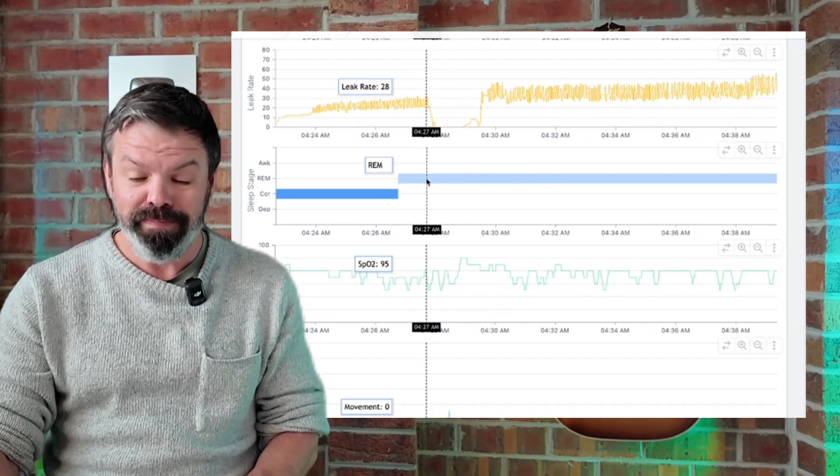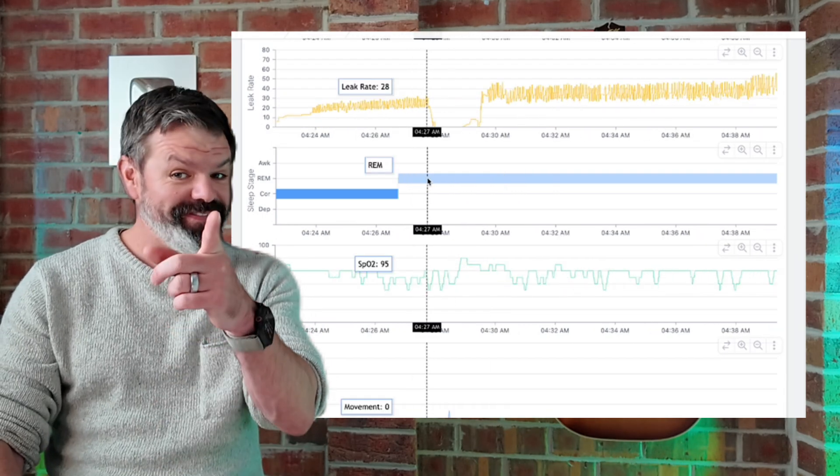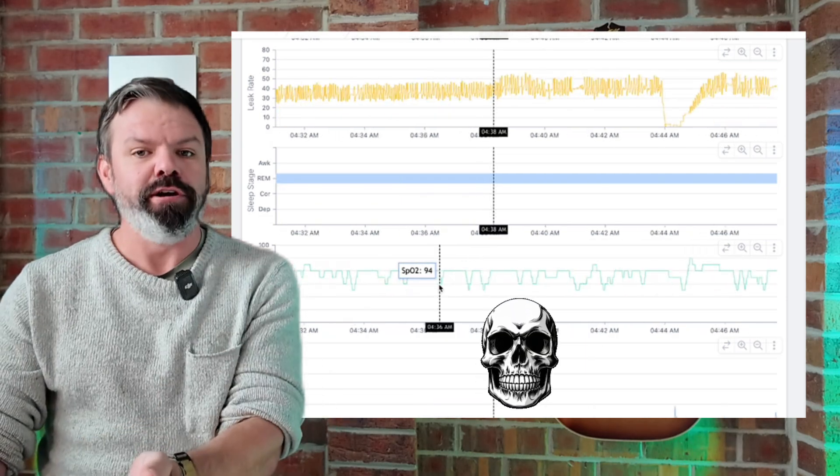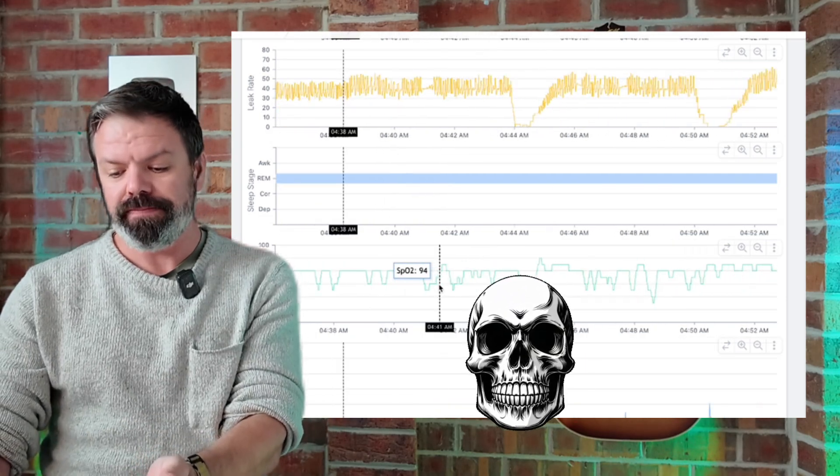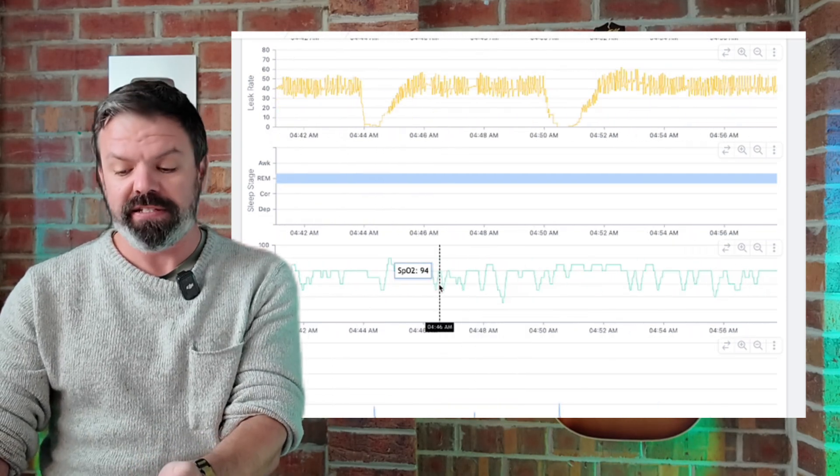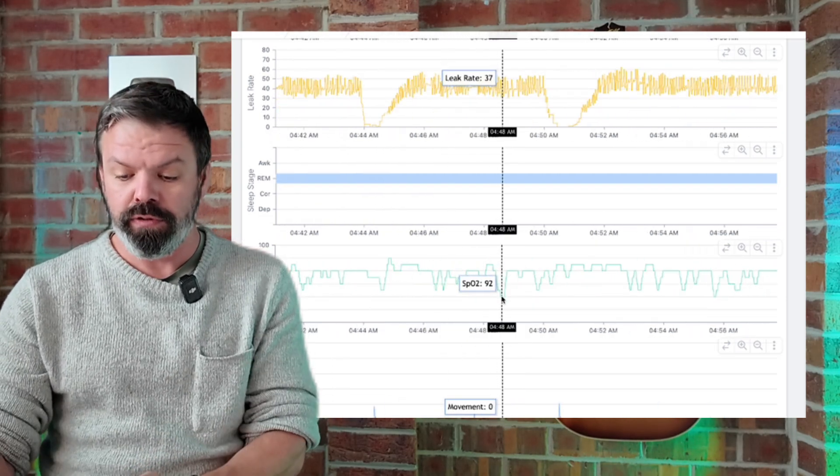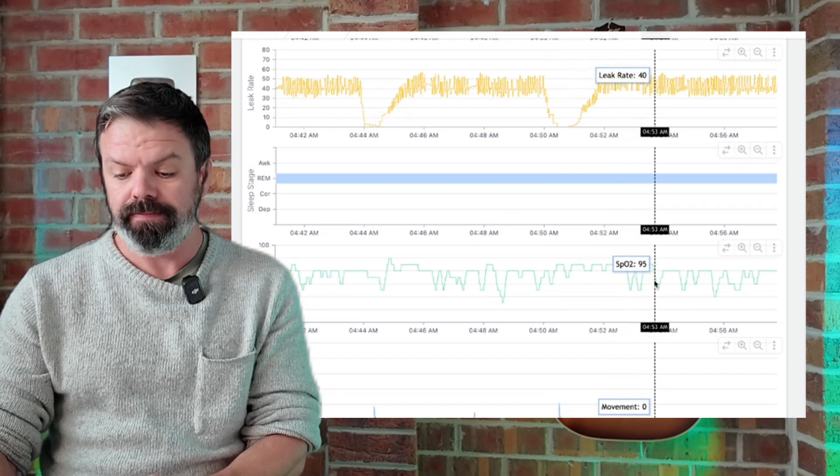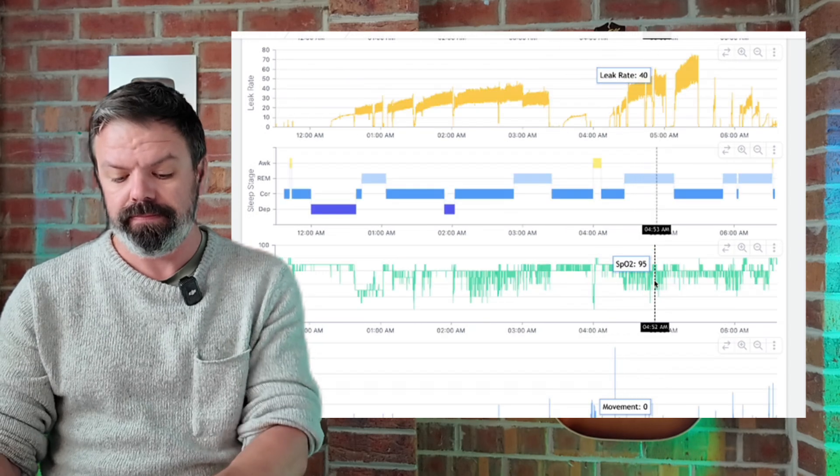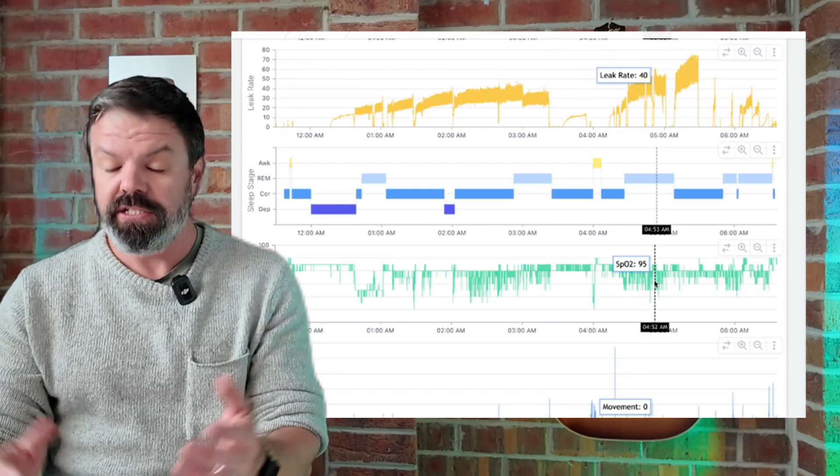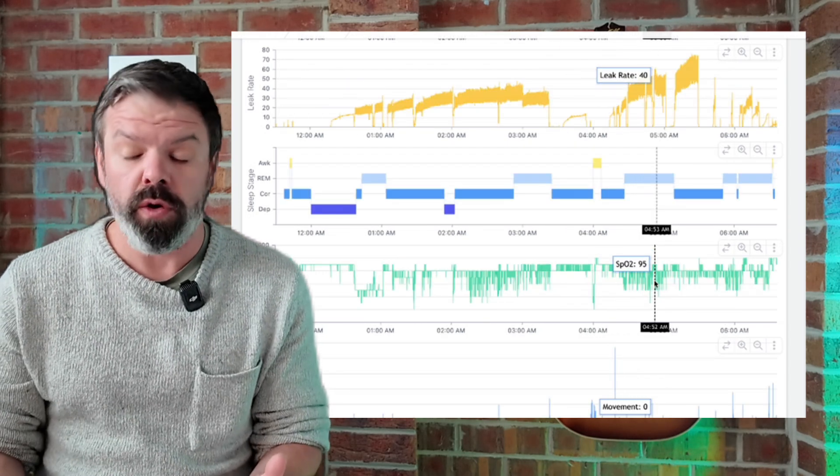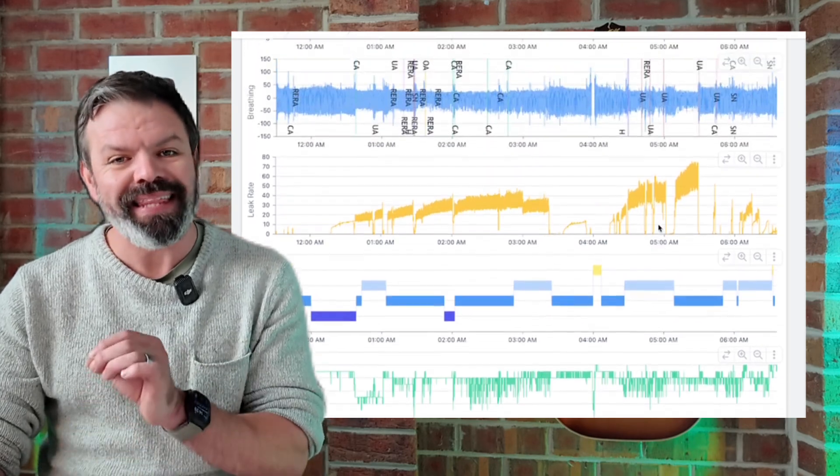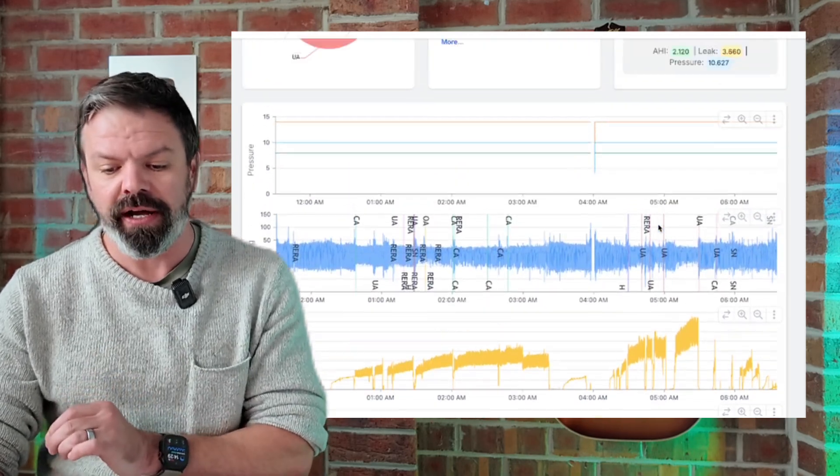We've hit REM. We've hit REM. And look at the O2 trace - very unstable. Look at all the dips.